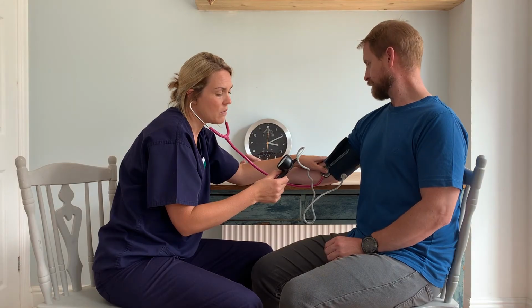And I'm waiting to hear the sounds. So I'm waiting to hear a dub, dub, dub sound. The first time I hear that sound, I'm going to make a note of when I hear it, and that's the systolic reading. So at 118, that's when I first noticed the first dub, dub, dub sound, so that's the systolic blood pressure reading. I can continually hear dub, dub, dub sounds all the way down. I'm releasing this valve slowly, and when I stop hearing those sounds, that's the diastolic blood pressure.